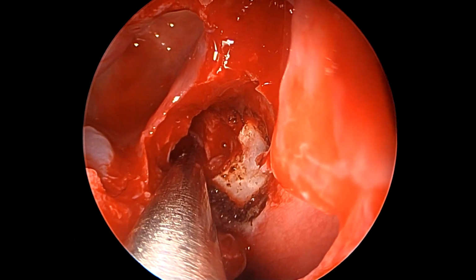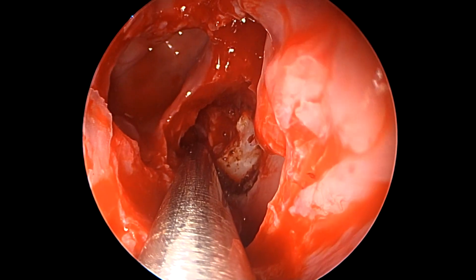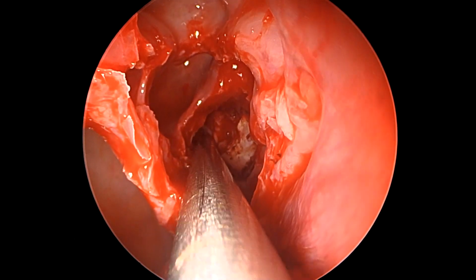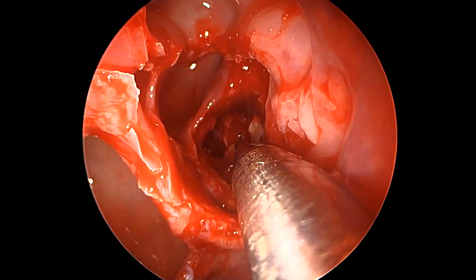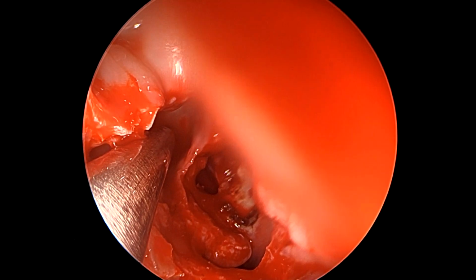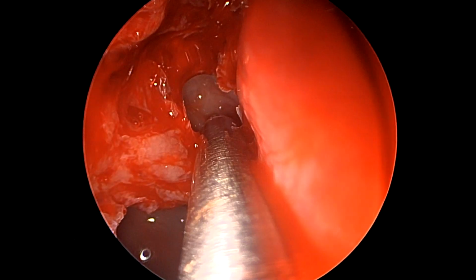Now we can see the clear bone of the septum and the vomer right in front of us, which is the medial part of the sphenoid sinus, and we see our probe entering the sphenoid sinus proper. The sphenoid sinus helps us guide our way because that is the lowest point and the median-most point of the skull base. And as we see, we can start removing septations and start coming more superiorly as we go more anteriorly. So we can see here, this is the posterior ethmoidal cell, which is posterior, lateral and superior to the sphenoid sinus. So we can remove these bony septations in some time.